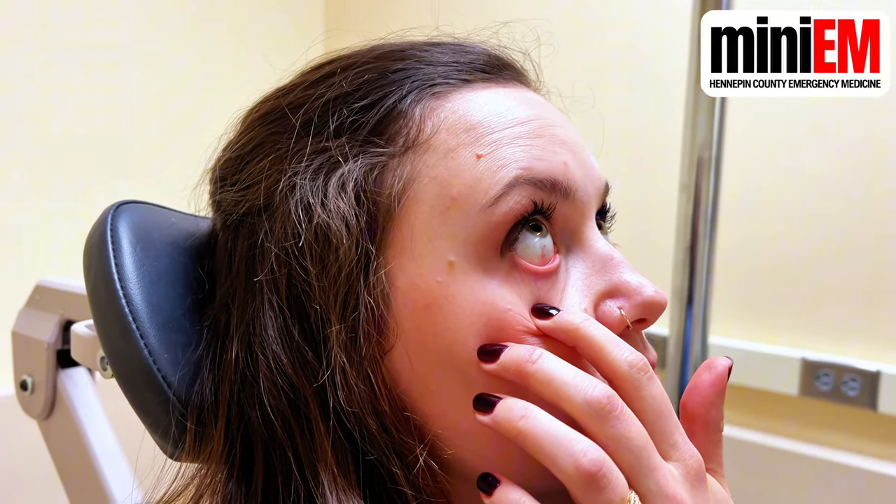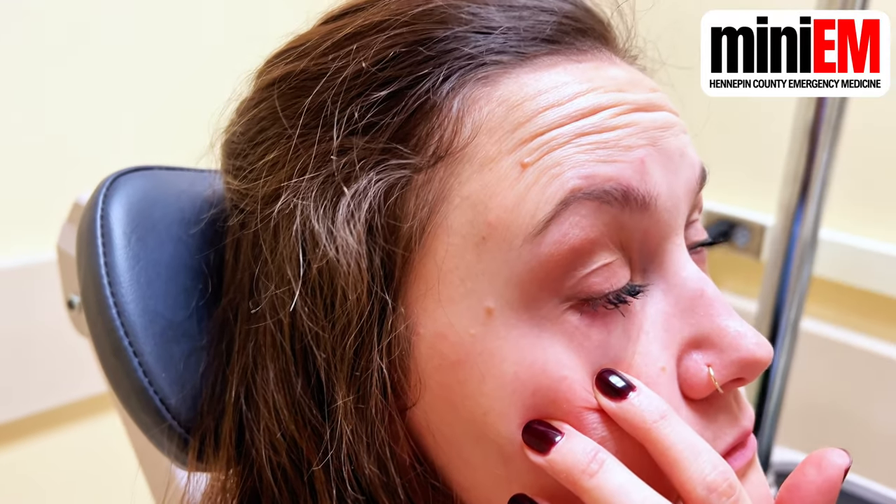First, numb your patient's eye by gently pulling down on their lower eyelid and placing one to two drops of either proparacaine or tetracaine onto the mucosal surface.